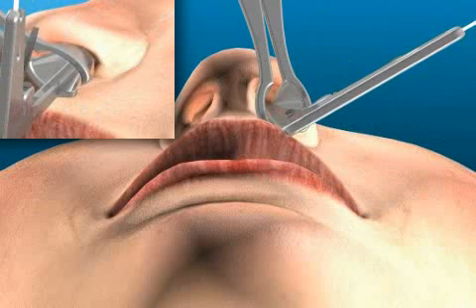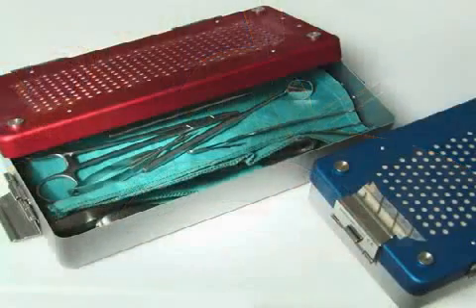The nasal speculum allows the surgeon to have a good view of the surgical area. It is important that these instruments, like all other surgical instruments, are only used after being sterilized.